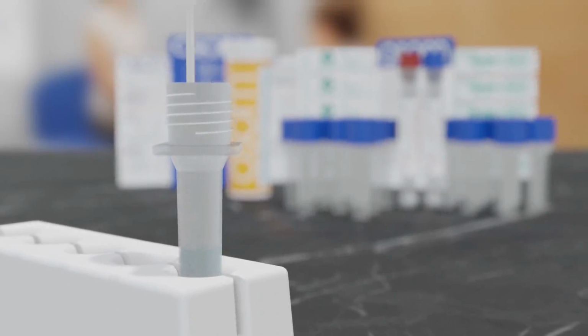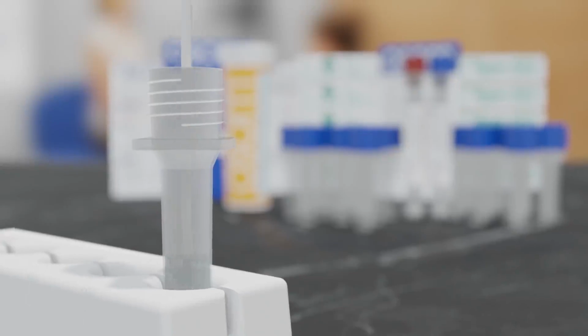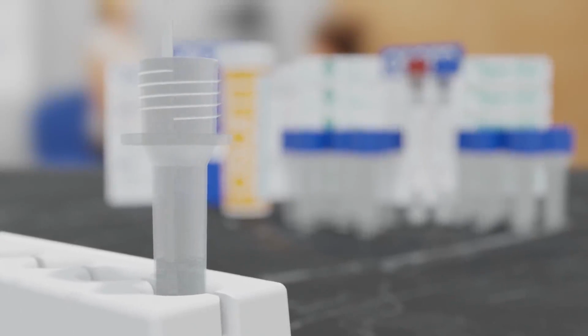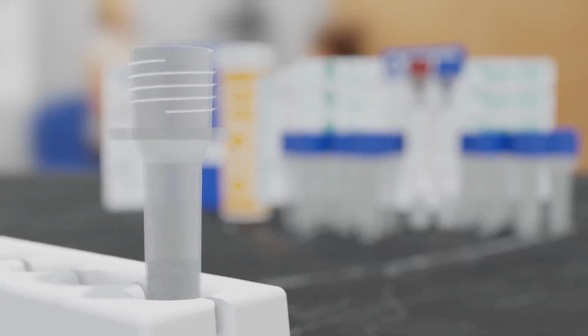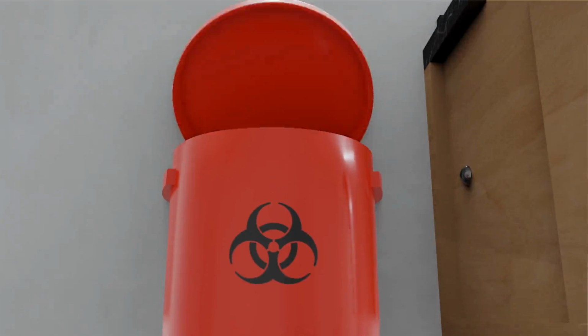Note: nasal swabs may not reach the bottom of the vial. Ensure that the swab is fully immersed in the liquid when mixing. Press the swab against the side of the vial to remove any excess sample in the swab. Discard the swab.